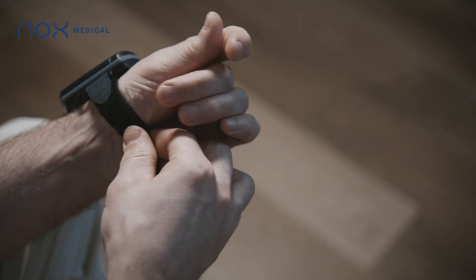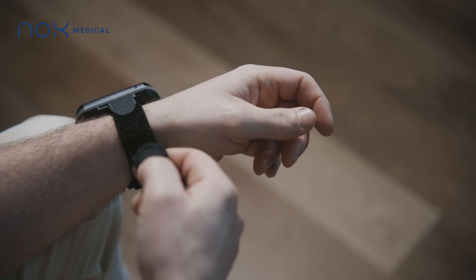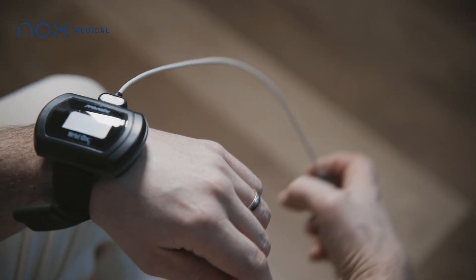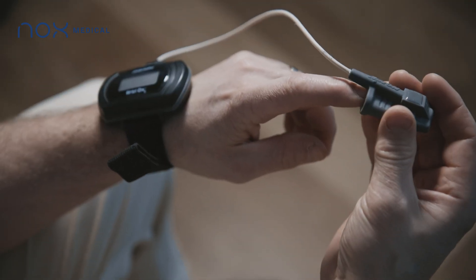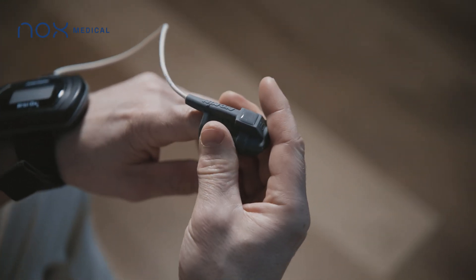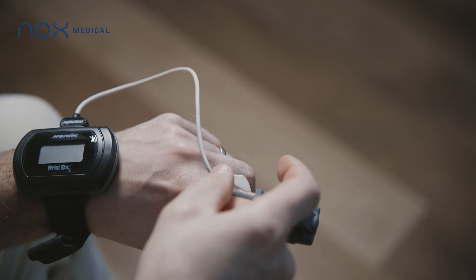The oximeter is placed on the wrist of either hand, like a wrist watch. Secure the Velcro strap around the wrist. Place the oximeter finger probe on the index finger until the finger reaches the end of the probe. You can secure the probe with tape.